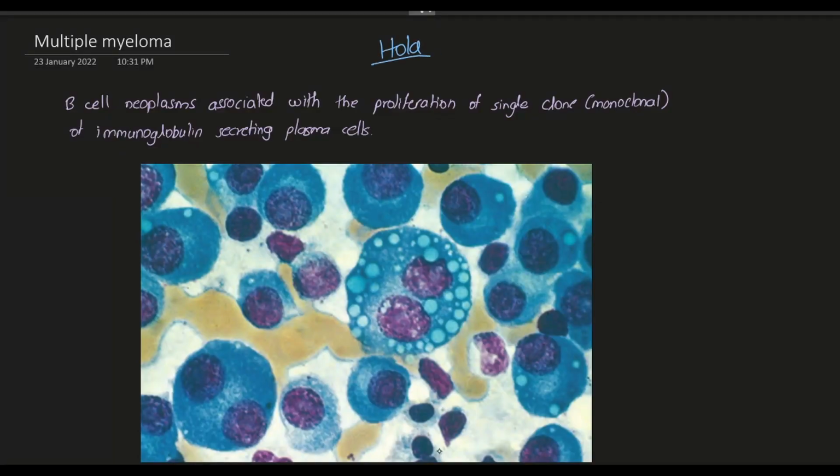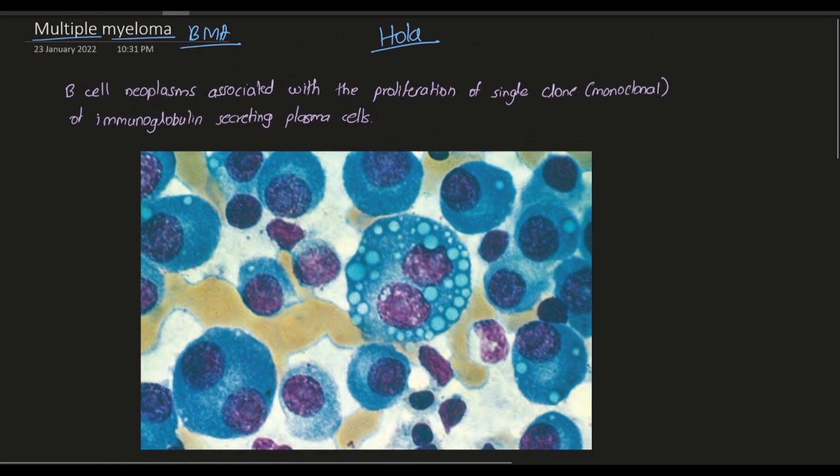Hola medicos, in this video I am going to explain to you about the multiple myeloma bone marrow aspirate. Okay, what is multiple myeloma?